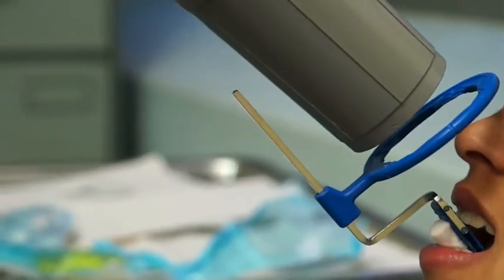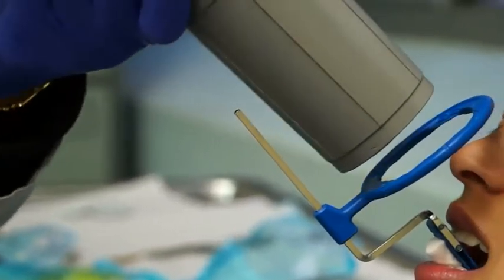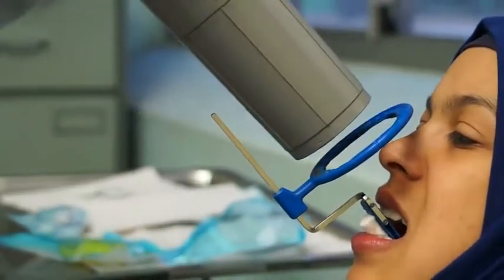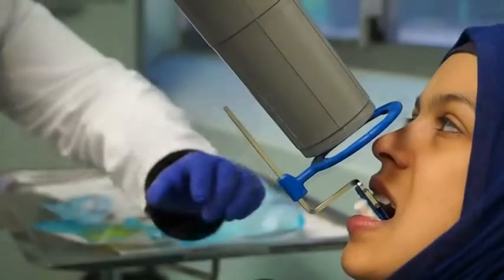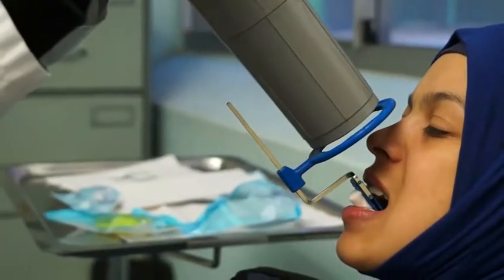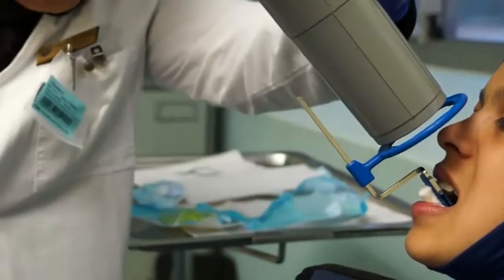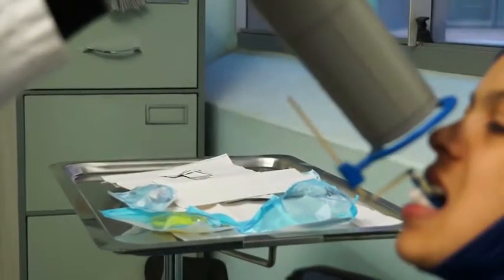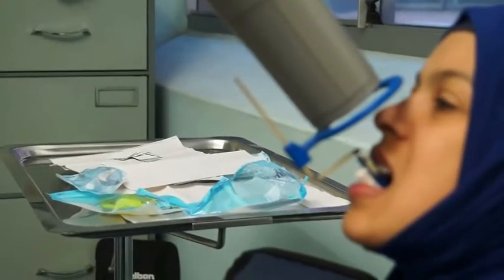I always make sure my cone is parallel to my indicator rod. If my cone is parallel to my indicator rod, then I know my central ray is perpendicular to the film. So for vertical angulation, the central ray must be perpendicular to your film, and you use the cone-to-indicator-rod alignment as your guide.